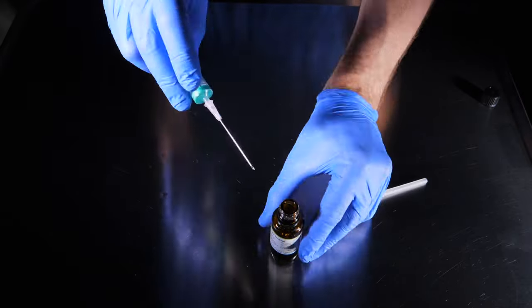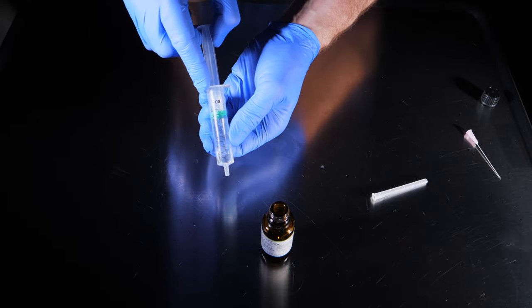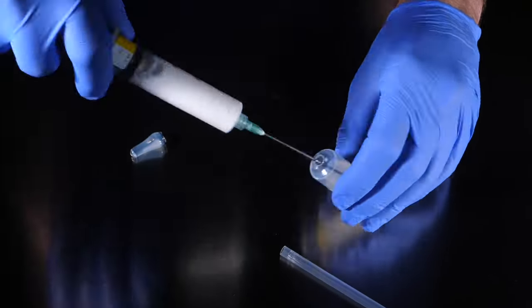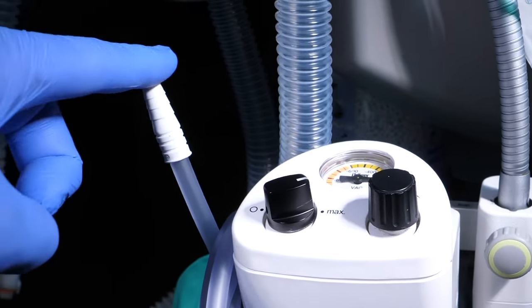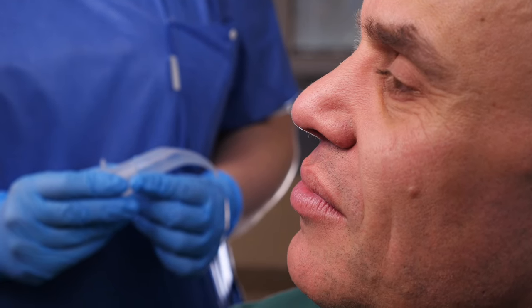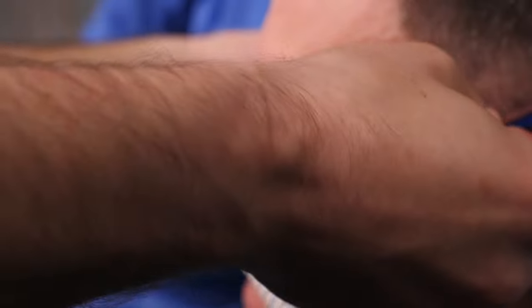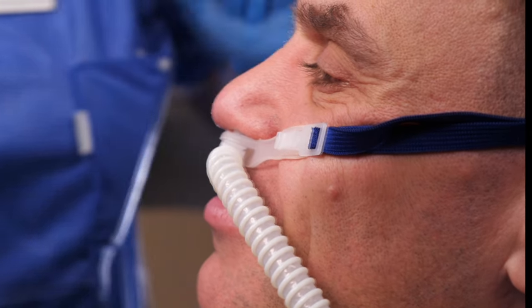Prepare high concentration local anaesthetics, usually lidocaine, for injecting through the working channel of the bronchoscope — one millilitre fluid and nine millilitres of air. Draw up suitable induction agents and confirm that the suction works. For a nasotracheal intubation, extra-long ET tubes or special nasotracheal tubes are recommended. An oral intubation also requires a bite block to prevent accidental damage to the scope or tube. Oxygenation should commence as soon as practically possible and continue throughout the procedure. A high flow nasal cannula is an effective method of maintaining oxygenation.